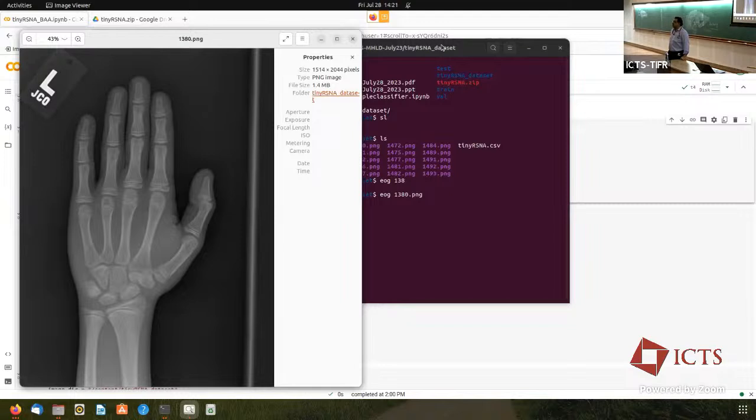In practice, however, if you do not have enough data, you cannot afford a 3-way split, then whatever is your validation score, you use that as your proxy for generalization error. And that's when resampling techniques like 5-fold cross validation come into play, because you can swap around the validation sets and then get a better sense of what the generalization score is.